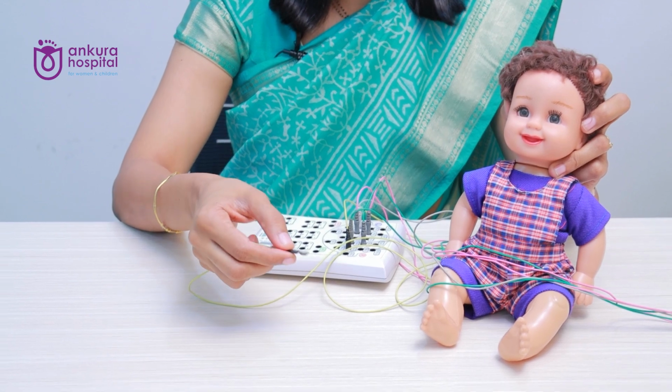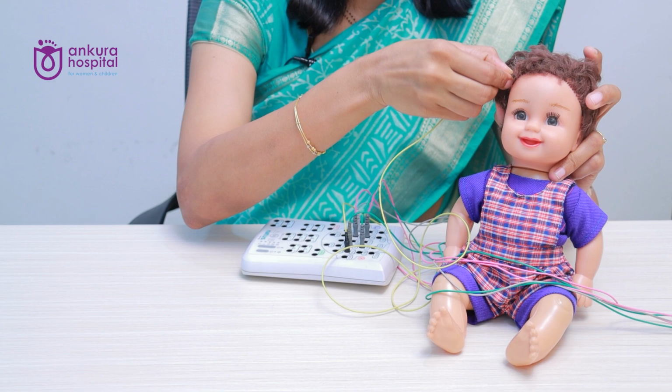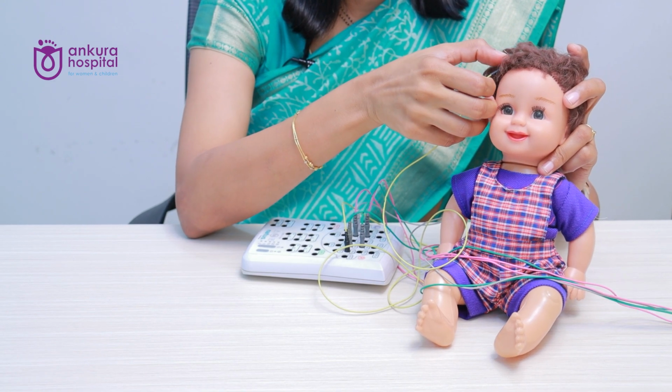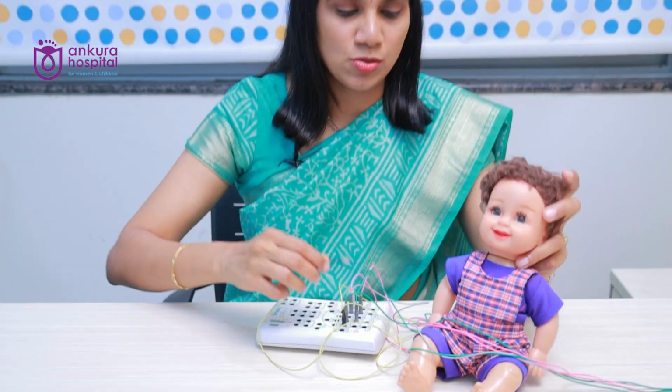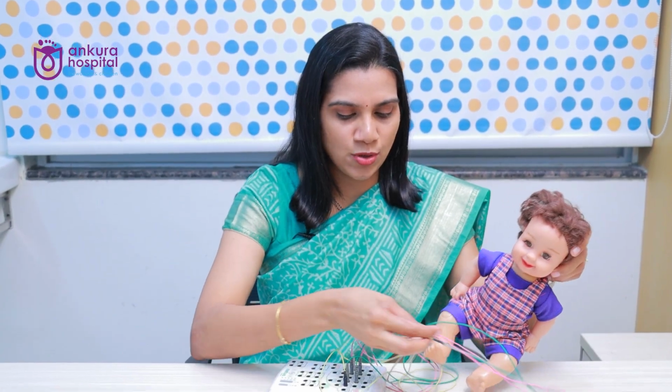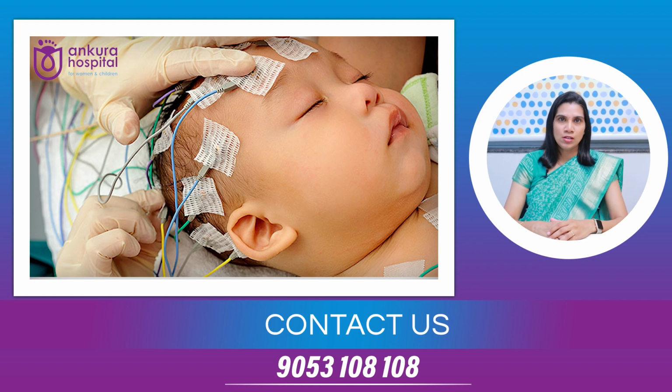This is dipped in a gel, as you can see the gel is already here, and attached to the child's head like this, or an adult's like this. This attachment will also have a specific pattern depending on the age of the child. So that is how it is done, and as you have seen there are many leads here, and no child will cooperate with so many leads on the head. So generally we do a sleep recording to get a clean record of the EEG.